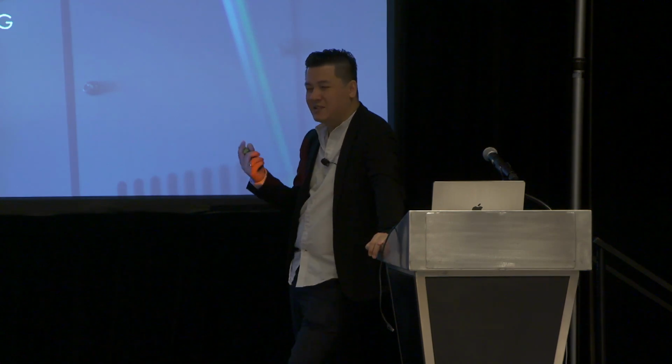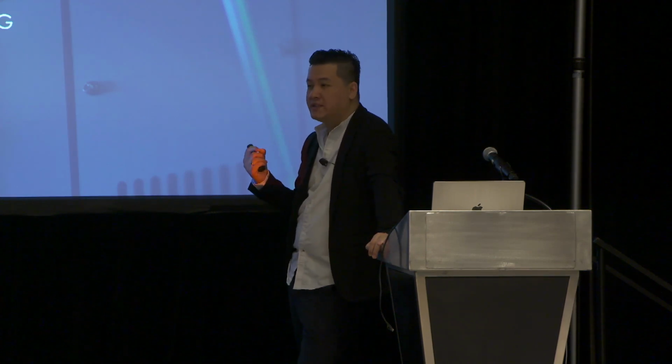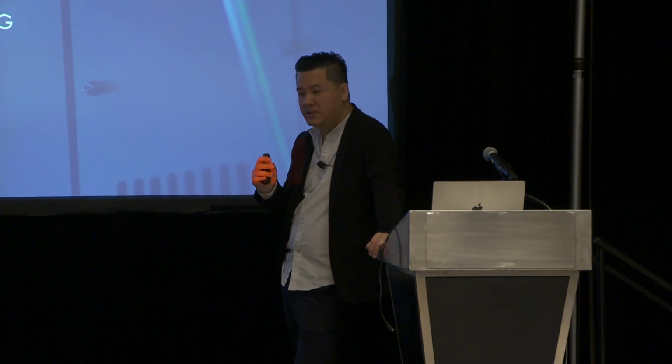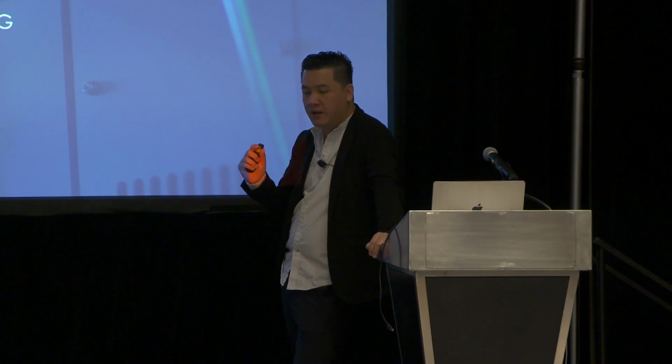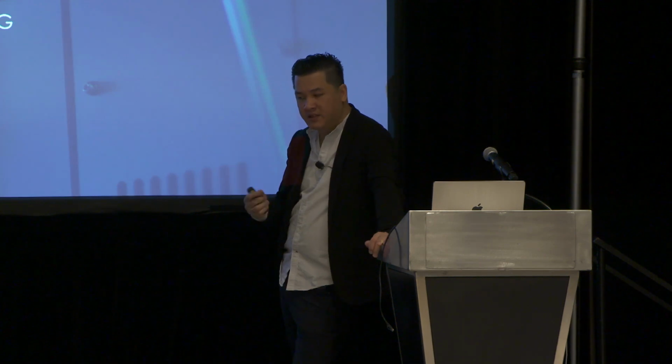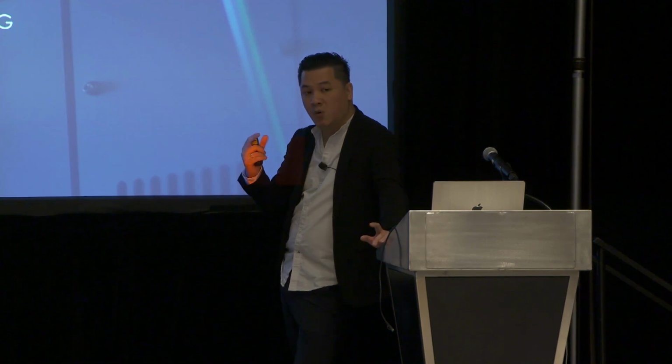The other thing, and this is a misnomer, is that everyone thinks they should print at 50 micron layers for everything. But the studies have actually shown that printing at 100 micron layers for the majority of prints makes the material stronger. The literature shows that 100 micron layer prints are faster and stronger. So unless you need that 50 micron layer accuracy, print at 100, because it'll double your productivity comparatively, and it'll also give you a more robust print overall.